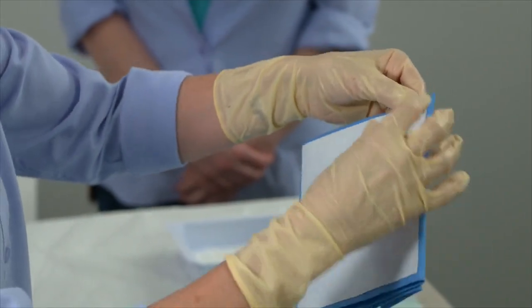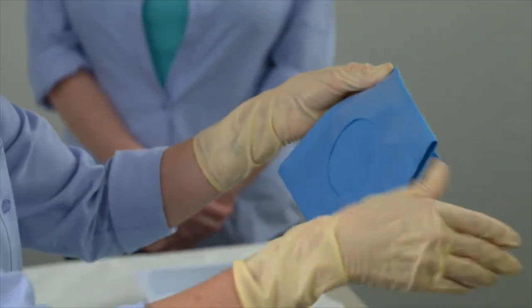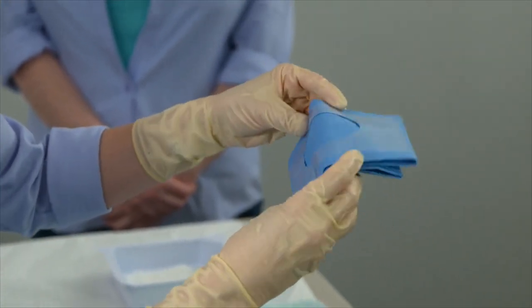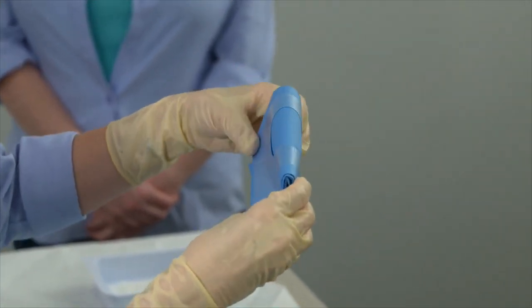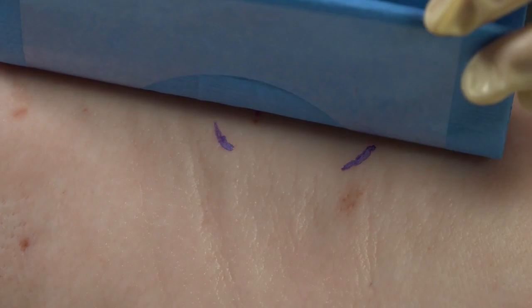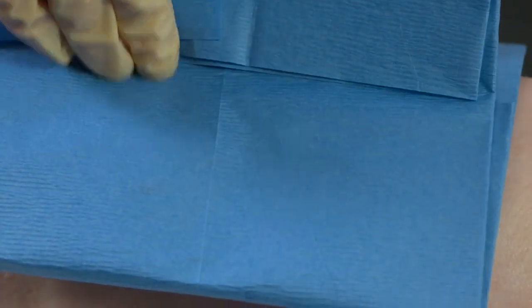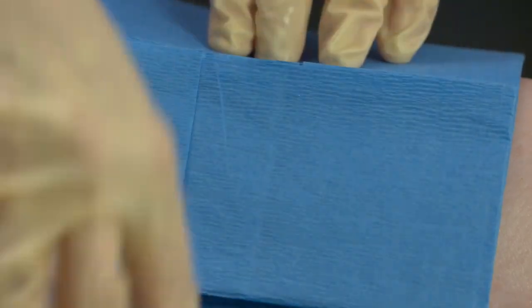With the aperture drape still folded, remove its adhesive backing. Fold the drape in half. Then align the proximal curve of the aperture with the proximal markings of the smart transmitter. Place the aperture of the drape, adhesive side down, over the incision area. Then, carefully open the drape, maintaining sterility.